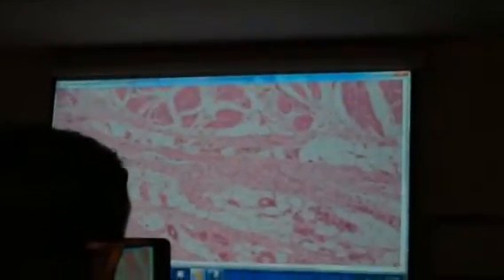Okay, the stomach. A lot of you noticed it said cardiac. I was impressed you were reading the slides. That just means the region of the stomach. It's from that region of the stomach. There's a part of the stomach called the cardia. Sort of oddly named.